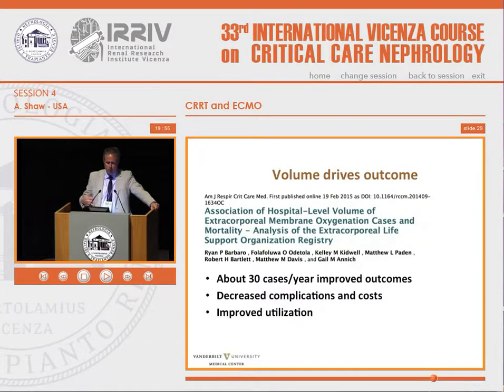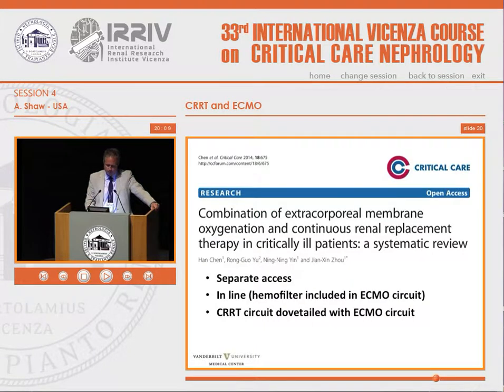I said earlier on, the more you do, the better you get. This is data from one of the most experienced centers in the United States, and they estimate that once you're up to a number of about 30 a year, that's when the payoff comes in terms of outcomes.